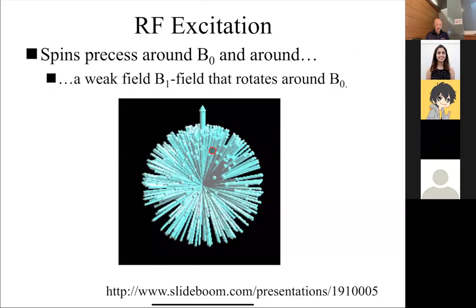But the thing is that with quantum mechanics, for those of you who know about it, you don't really know what the state is until you measure it, right? So you just have to assume that spins can be in all these different probabilities, and it's like all the spins are spinning around, but just the net is there. So you could imagine it's sort of spinning around its own axis, but these are all classical analogies for things that we don't really understand. Okay. All right. Anything? Yeah, question.